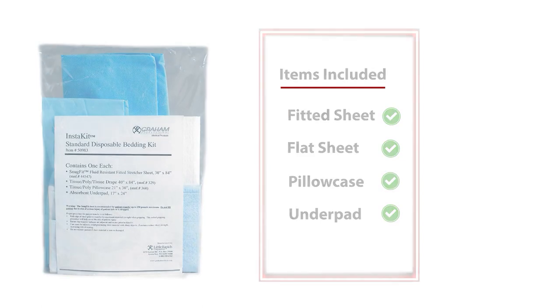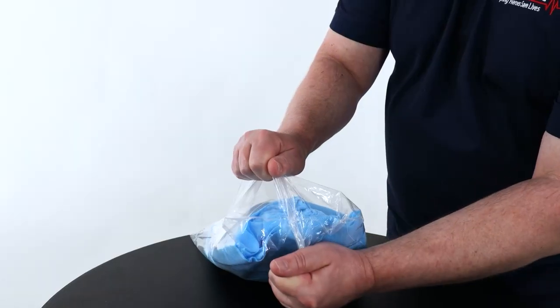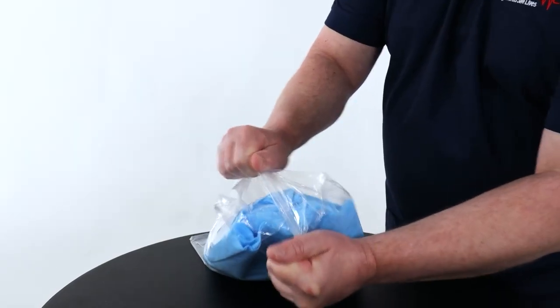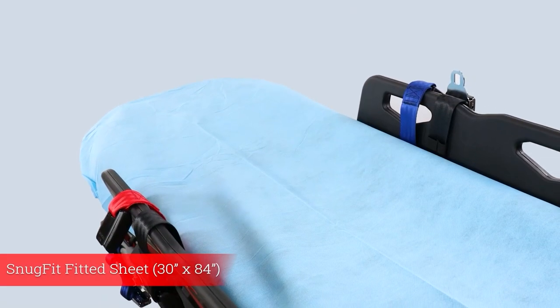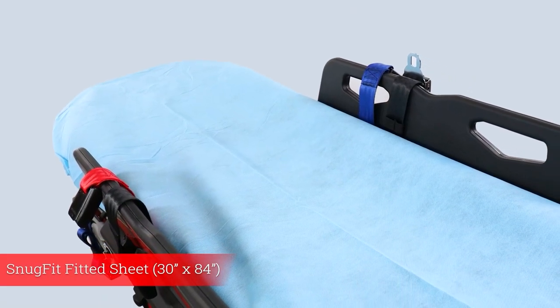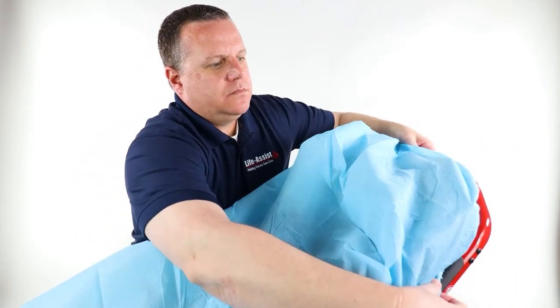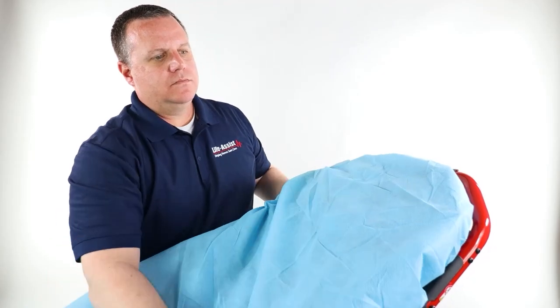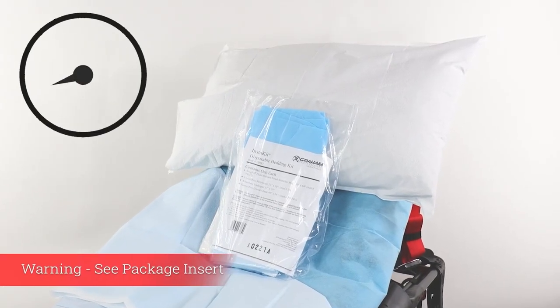Packaged in a latex free, compact, clear, heat sealed bag, the Instakit is easily identifiable and takes up minimal space. Included is a snug fit fitted sheet that has elastic ends and fits most standard cot mattresses. Furthermore, it's fluid resistant and allows for patient transfers up to 250 pounds.